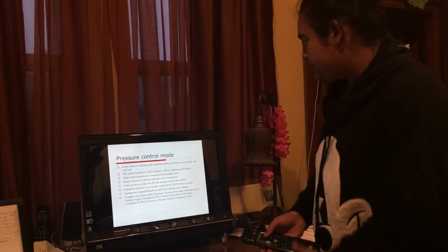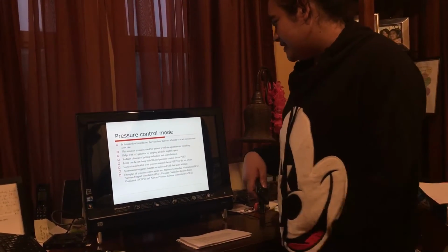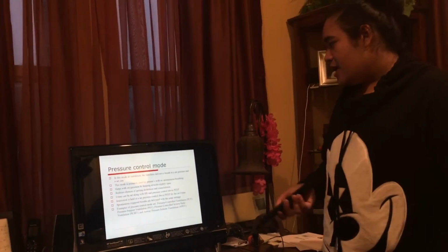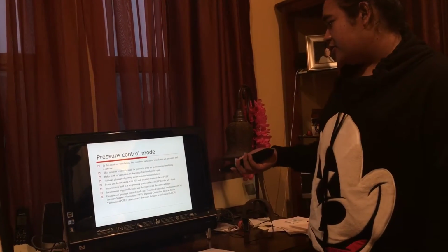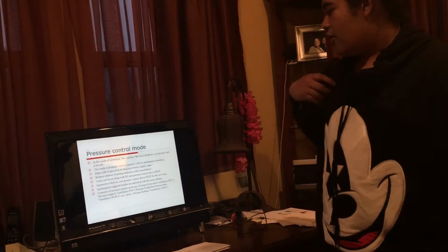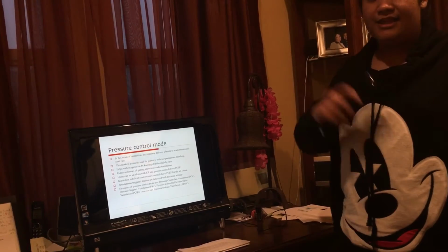Okay. Sorry about the intermission. So some examples in this one are pressure controlled ventilation or PCV, pressure support ventilation or PSV, pressure controlled inverse ratio ventilation or PCIRV, or APRV, which stands for airway pressure release ventilation.